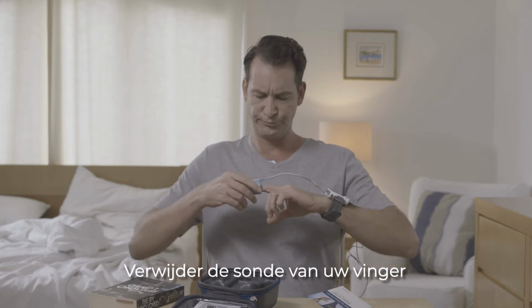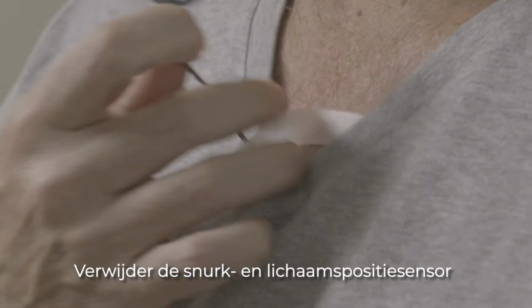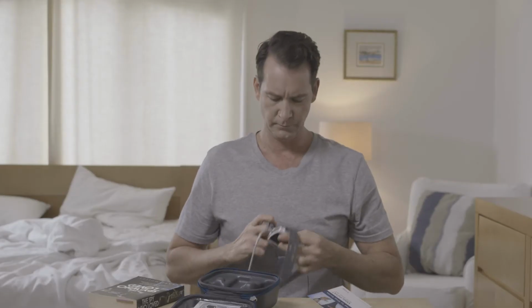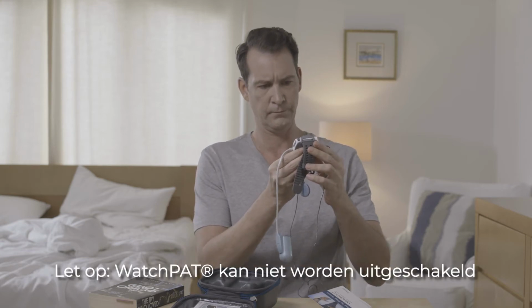Remove the probe from your finger. Remove the snoring and body position sensor, and remove the device from your wrist. Please note, WatchPAT cannot be turned off.